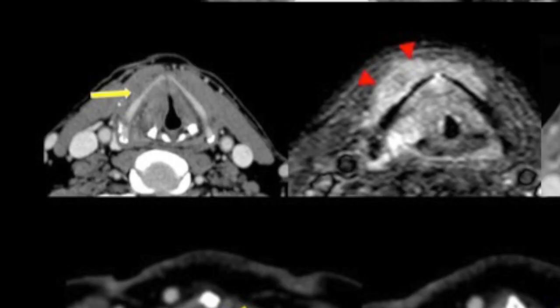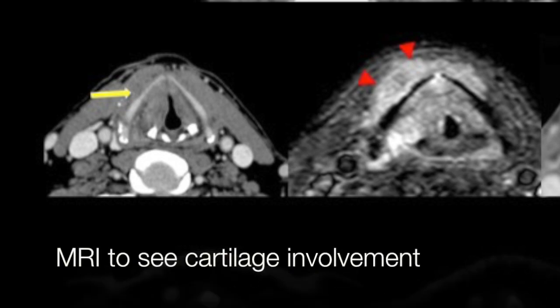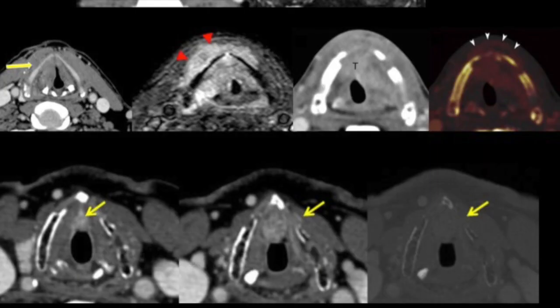In the next figure, there is a white line of the cartilage with suspicious involvement of the visceral space, which is definitively seen on MRI. MRI upstages this patient to T4A, making them a candidate for total laryngectomy. Sometimes even PET can help in picking up thyroid cartilage invasion and previsceral space involvement, as shown by the arrowheads indicating SUVmax into the previsceral space similar to the malignancy in the glottic region — confirming T4A.